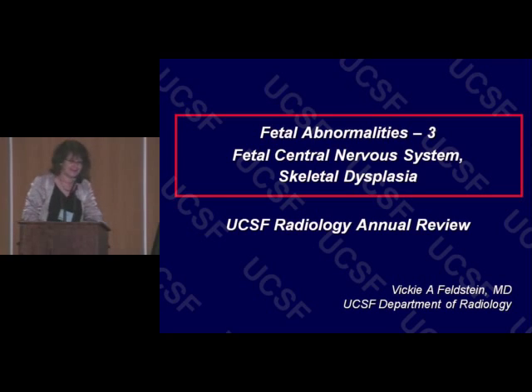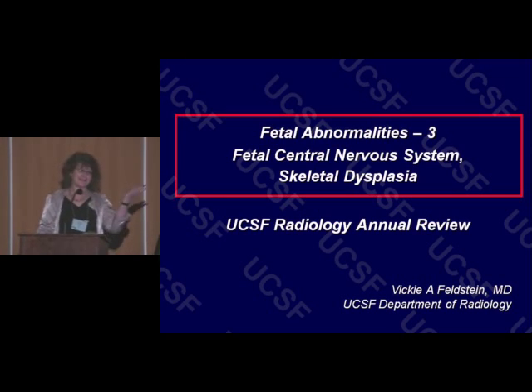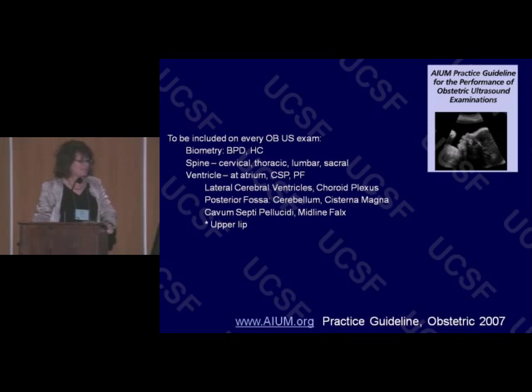Okay, the third in this trifecta will cover fetal CNS and skeletal dysplasia, and then you'll know everything. I just want to reference the guidelines for performing OB ultrasound exams and highlight the parts that are specifically mentioned in reference to fetal CNS.